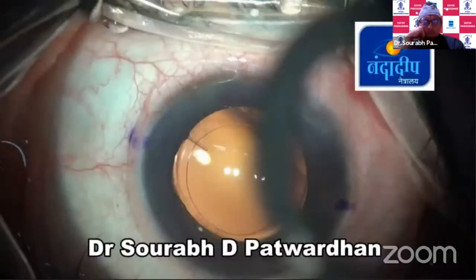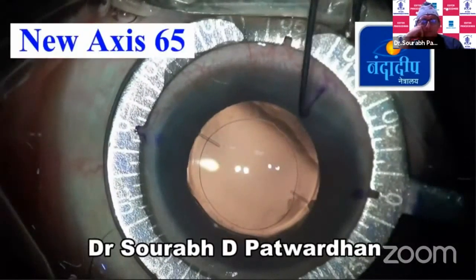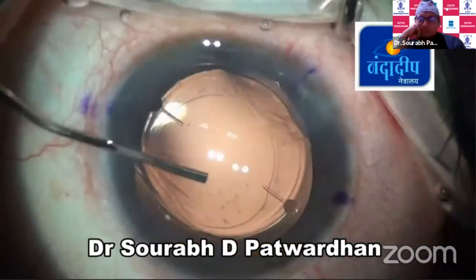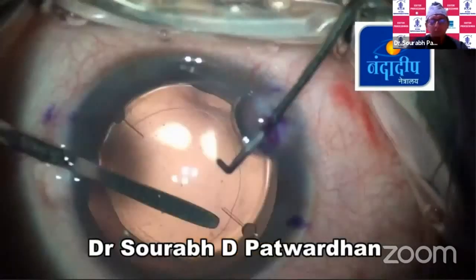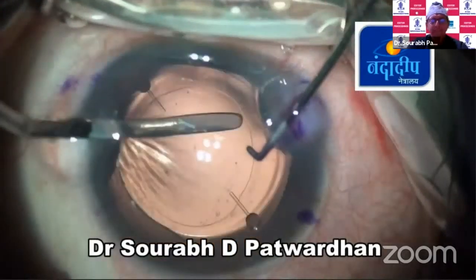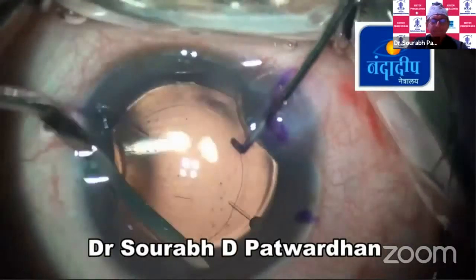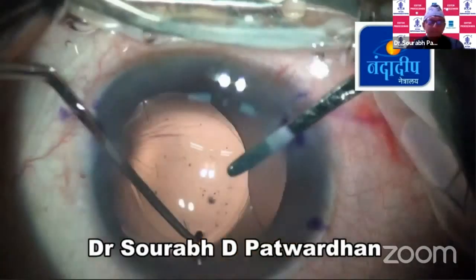This is a hydrophilic plate haptic design. So you can mark the new axis, which is 65 degrees here, by marking the 180 degrees using the iToric marker, or simply you can measure 85 degrees counterclockwise from the position of the IOL, which doesn't require any reference marking. Then we have to separate the anterior and posterior capsule. You can use the iris spatula. You can also use the cohesive viscoelastic agent to split or cleave the anterior and posterior capsule.